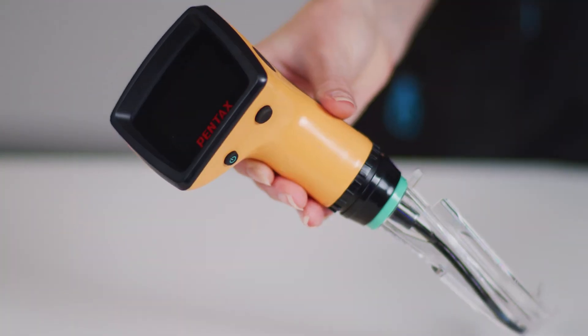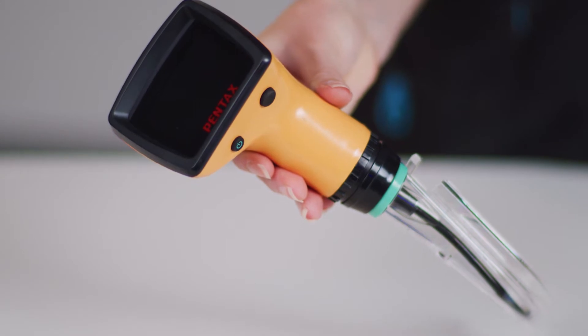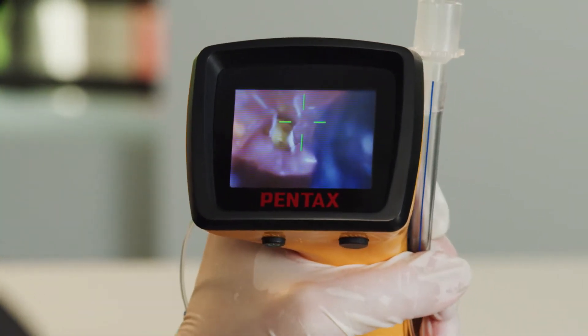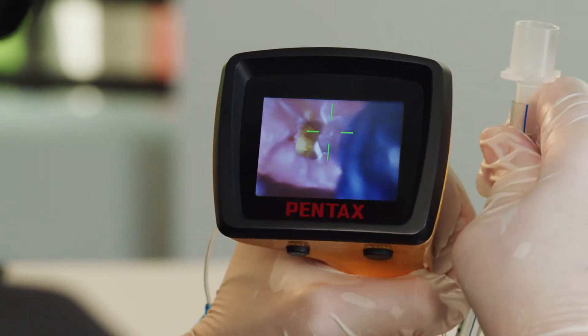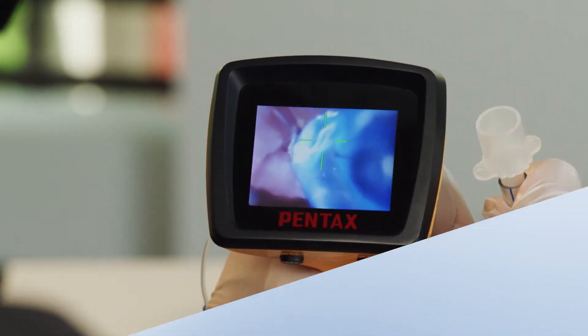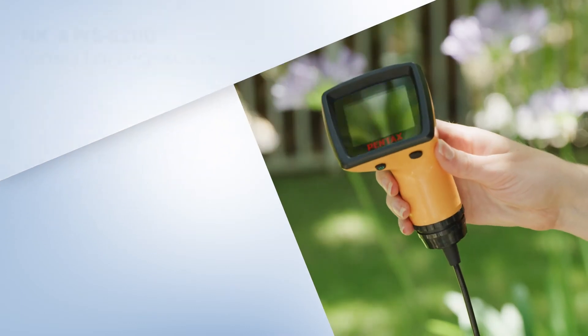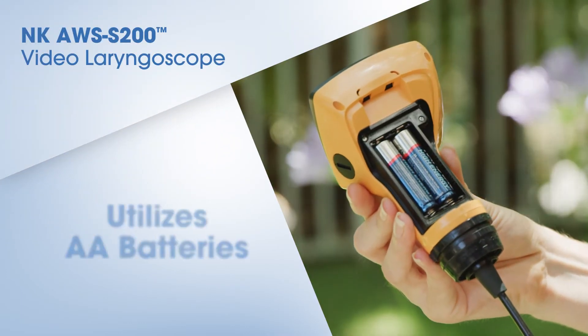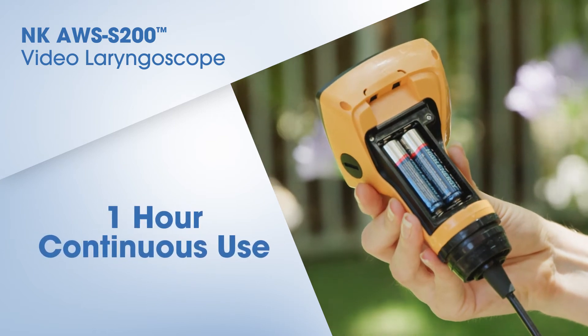The handheld unit is lightweight and portable for use in the field. The monitor enables smooth and accurate operation, with the operator able to continuously observe the intubation procedure. The NK-AWS S200 video laryngoscope works with ordinary AA batteries, supporting ease of use outdoors.